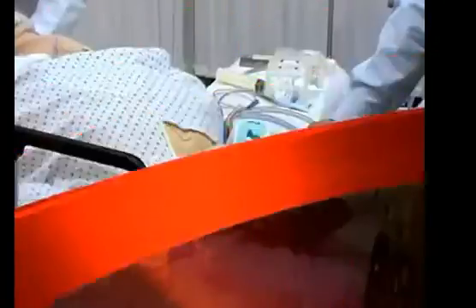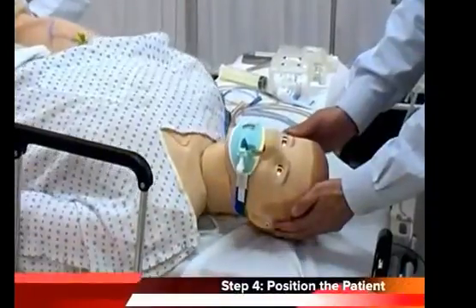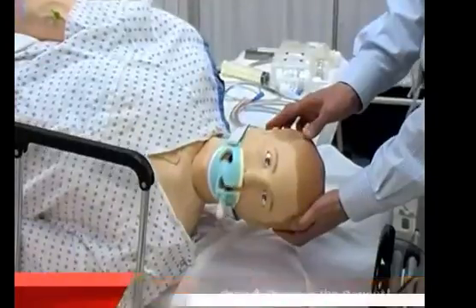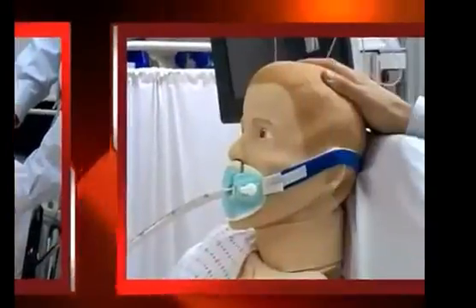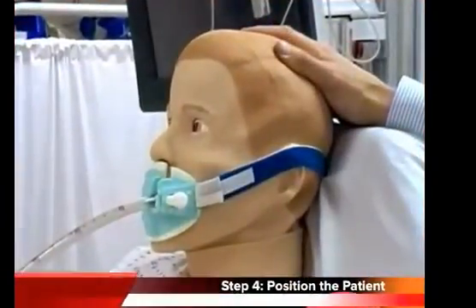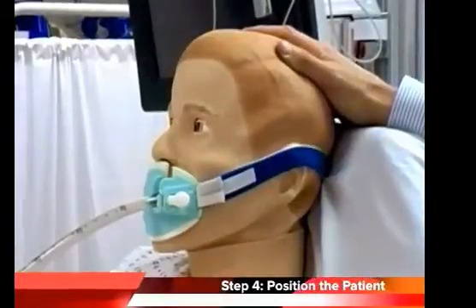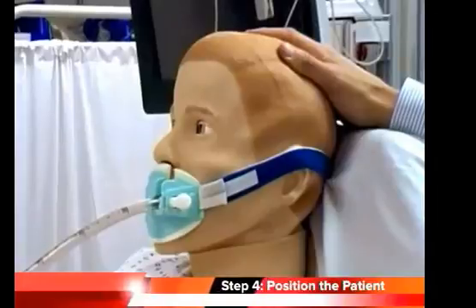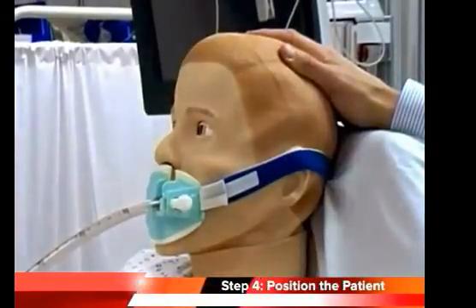Step four: position the patient. In general, it is recommended to place the patient in the left lateral head-down position in order to maximize gastric emptying. However, the upright position may be required in some circumstances — for example, the restrained patient. Avoid the supine position, since this will place the patient at the greatest risk of aspiration.